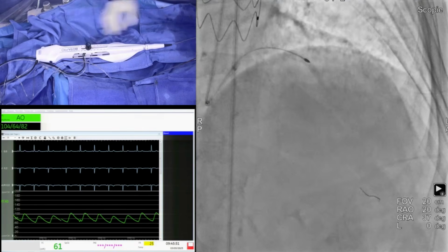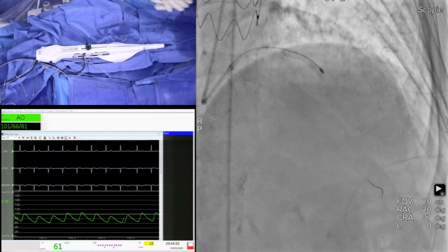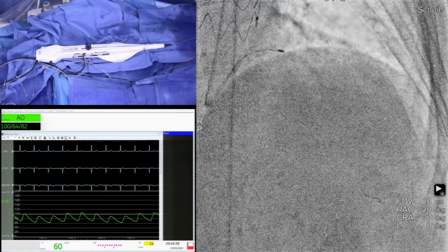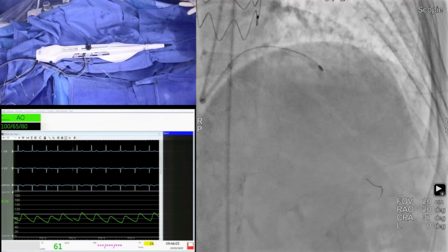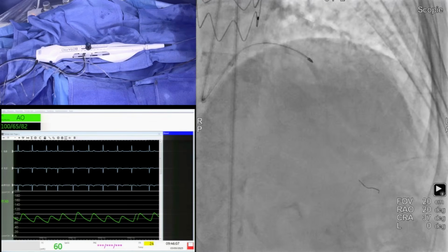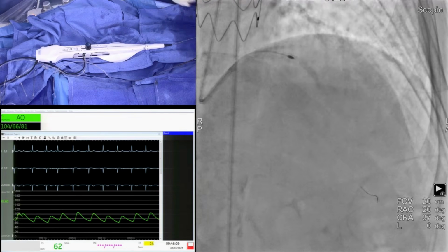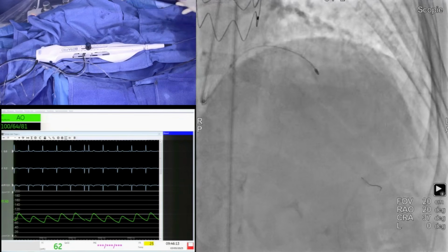For the moment, I don't have any resistance on the proximal part, so that questions the size of the burr. But when we go in front of the second diagonal, and you can see on the screen the calcium on the ostium of the second, I feel some resistance. That's why I go on the pecking motion more intensively at this level. Do not try to cross in one time because you risk entrapping the burr.